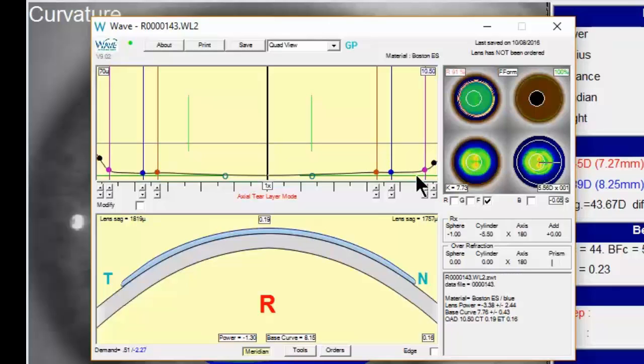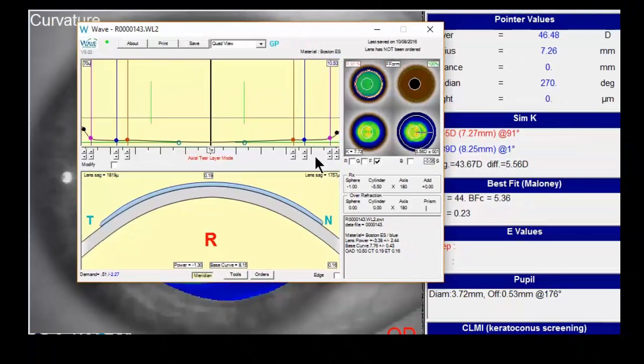Whenever you start with a lens that fits well and centers well, you can avoid many of the compounded problems or challenges that come along with multifocal fitting. Secondly, it's helpful to know which eye is the dominant eye and which eye is the non-dominant eye. You also want to think about what the patient has been wearing currently. Are they over minused or under minused? Are they wearing monovision or previous multifocal lenses?